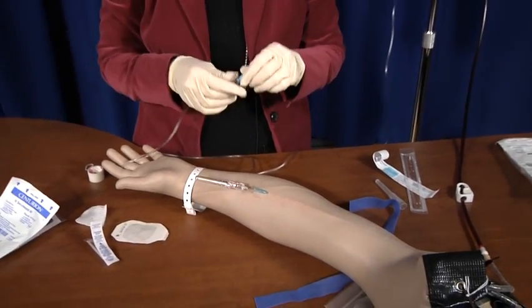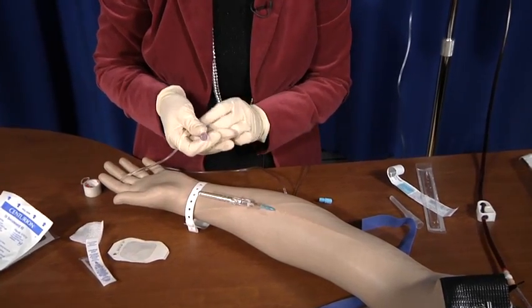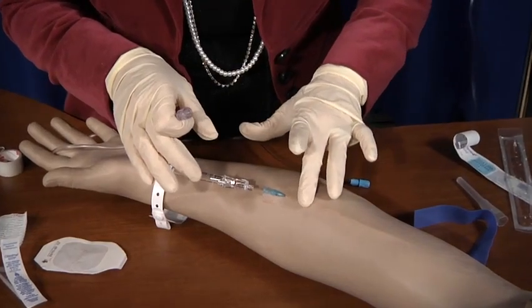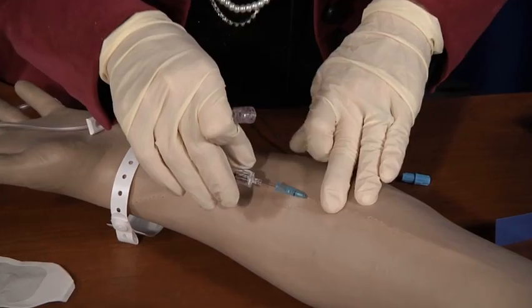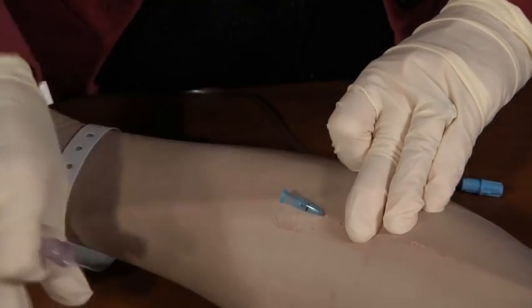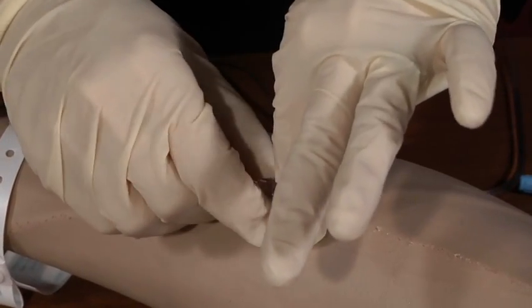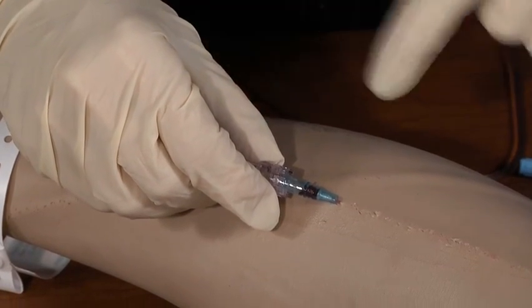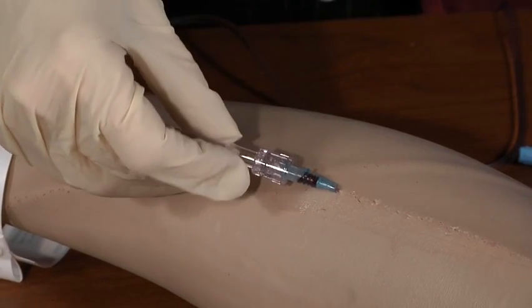You want to be very careful that we don't touch either end of this, the hub or the end of the tubing. We're going to place pressure on this vein here to stop the bleeding when I pull out this needle. So it's kind of hard on this one. I'm going to press hard. Push the button. Needle comes out. Tubing goes on. Twist it. I did not touch the inside of either of those. You try not to touch your site. You can see there's blood in there. You're in the right place.